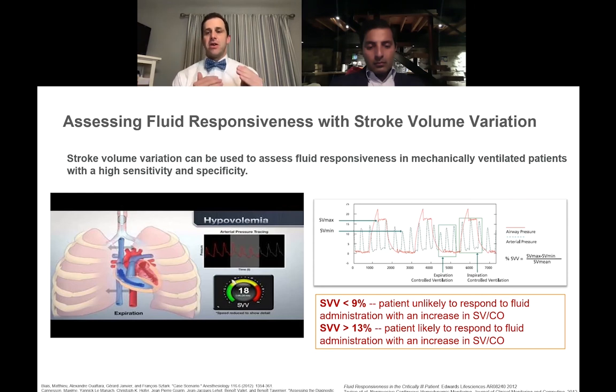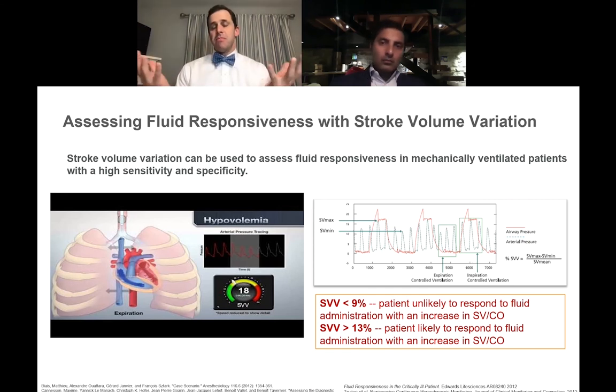If you look at this variability across the ventilatory cycle, if you're seeing these swings in the hemodynamics up and down, that should trigger your mind to think about why that is occurring. Well, as intrathoracic pressures go up and down, that impacts right ventricular, or really biventricular, filling. As the pressure goes up in the chest, there's less blood in the heart, and as the pressure releases out of the chest, there's a little bit more filling that we can see.